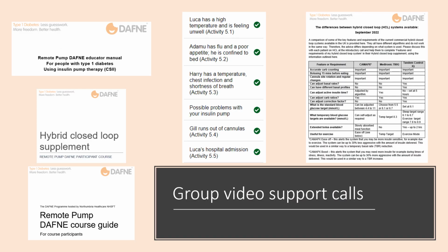Group video support calls follow the same format as those for Remote DAFNE. Discussion of participant experience during the week, what's gone well, queries and points for discussion from the online content, referring to online activities as necessary, feedback on carb counting of a specific meal, and discussion of the Pump DAFNE diary or CGM and the focus of the week.